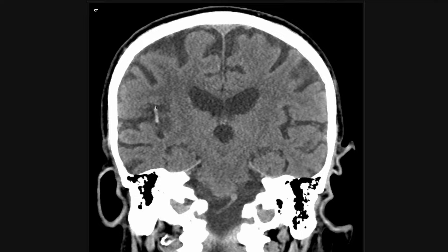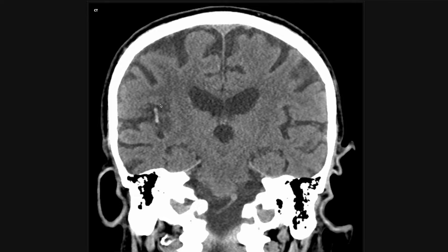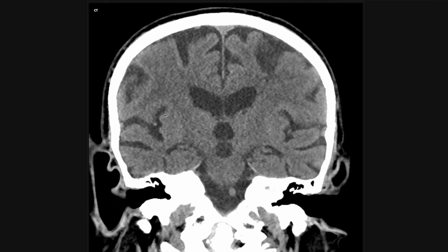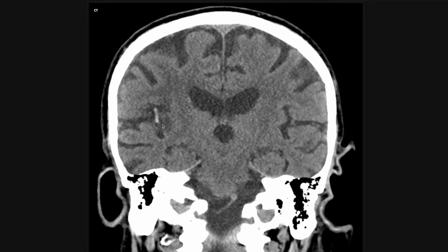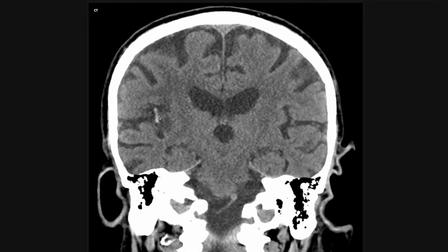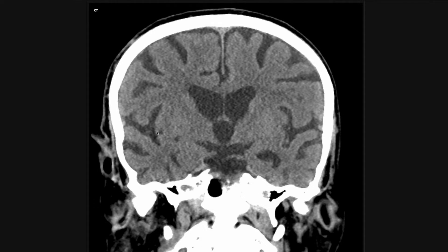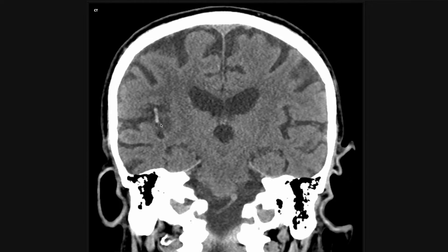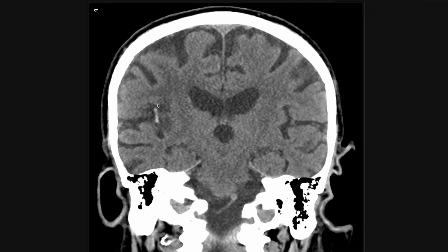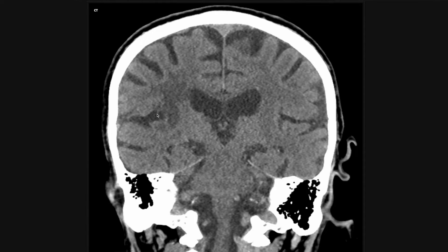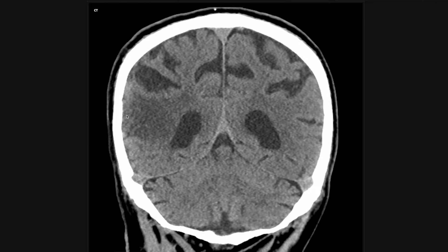You can actually see a dense vessel here — this is probably where the thrombus is, just like in the last case. Thrombus is dense, so a vessel that pops suddenly like that is thrombus. As you track it back, it's less dense; going posteriorly it's much more dense — that's where your thrombus is. This is the sequela of that thrombus: an acute, evolving right MCA territory infarct.